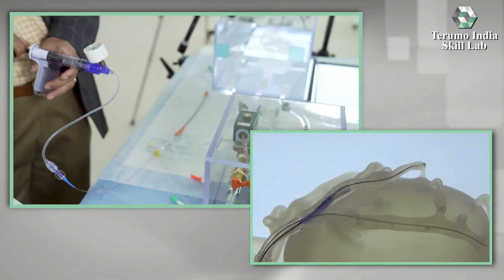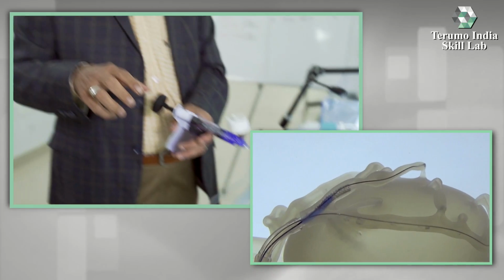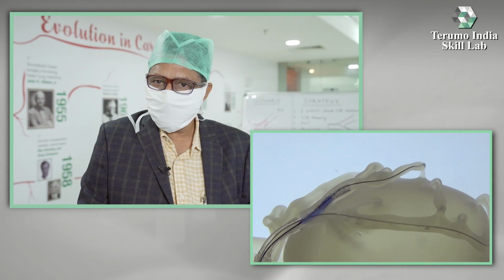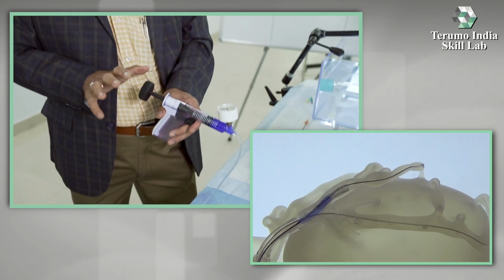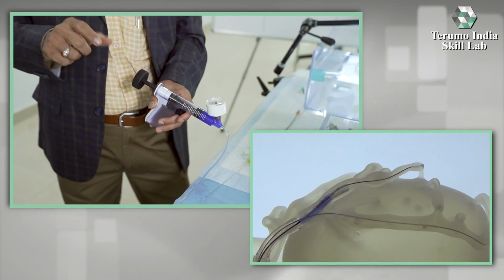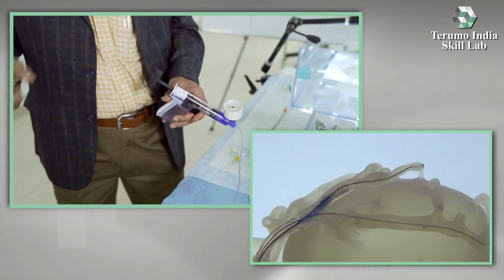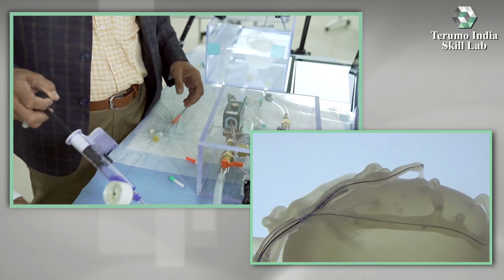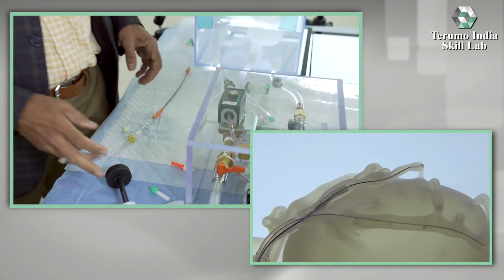So now we have inflated the side branch stent with a 3 mm balloon, and now you can nicely see the ostium is well flared, and now we are ready for the first kiss of the DK crush. DK crush is a double kissing technique. So now we are ready for the first kiss. So we need a 3.5 balloon for the main vessel.